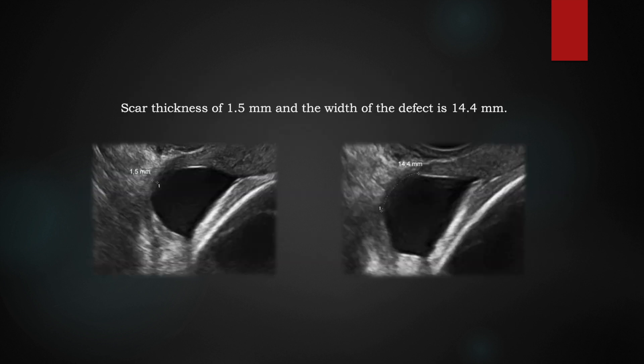Here is one example in which we can see thinning of the scar at 1.5 mm, with ballooning of the membranes. This thinning of the scar is seen for a length of about 14.4 mm, approximately 1.5 cm. All these details need to be mentioned in the report.